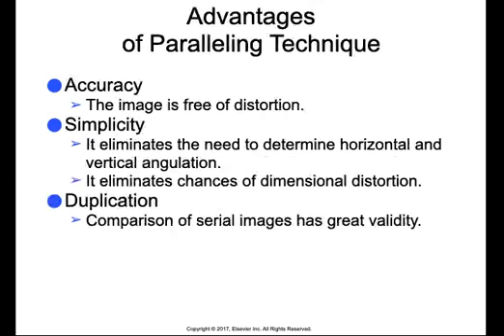So some of the advantages of the paralleling technique are, number one, accuracy. This is because the image is free of any type of angular distortion, and so you'll have a straight on shot, as they call it, from the receptor all the way through the tooth and onto the PID.